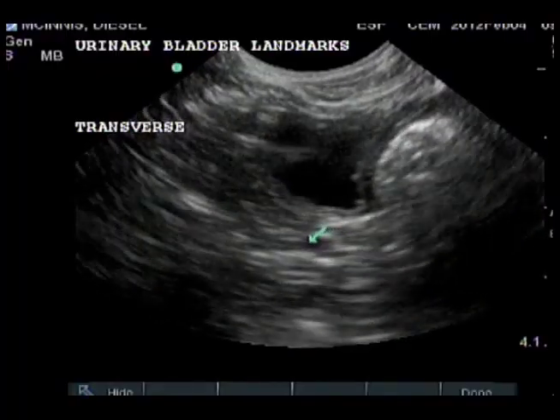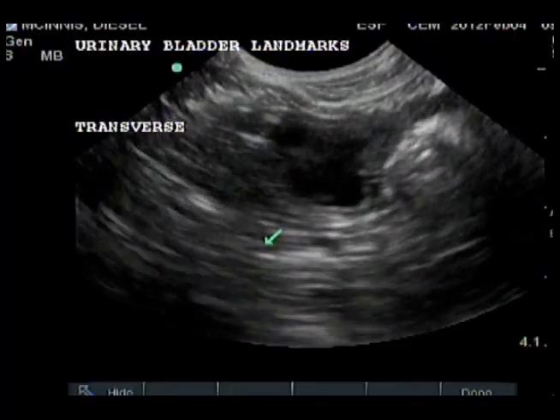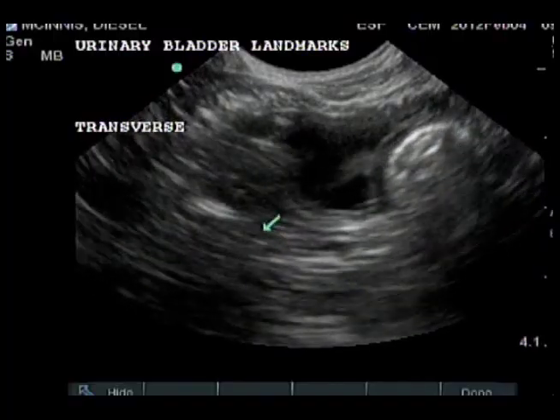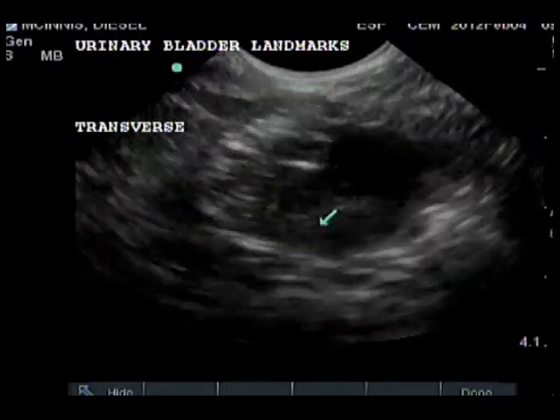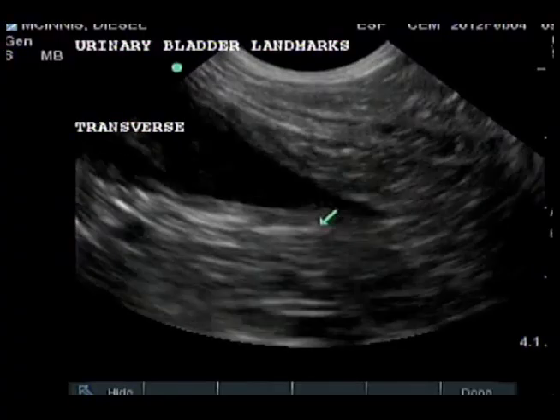The caudal vena cava is dorsal and to the patient's right. If the patient is an unspayed female, the uterus and cervix are dorsal to the bladder. In male dogs, the prostate is caudal to the urinary bladder.